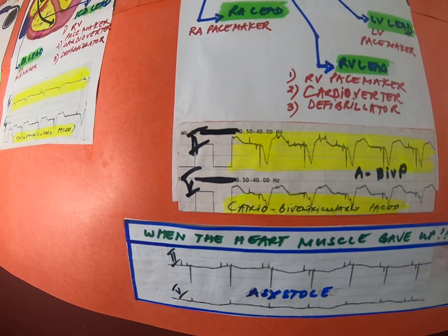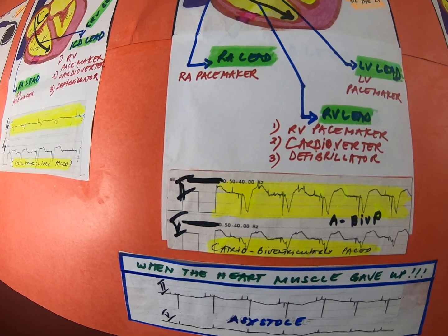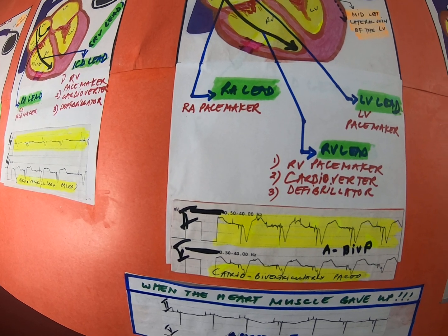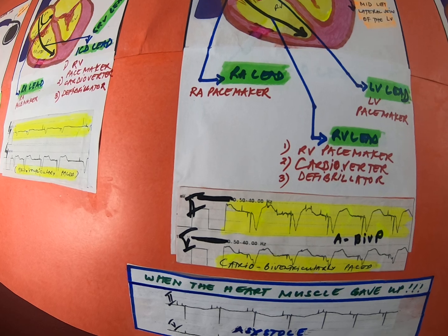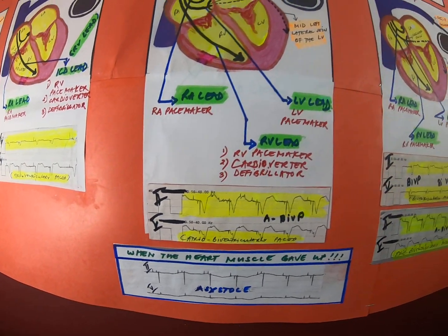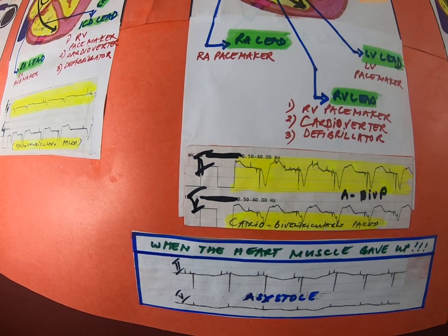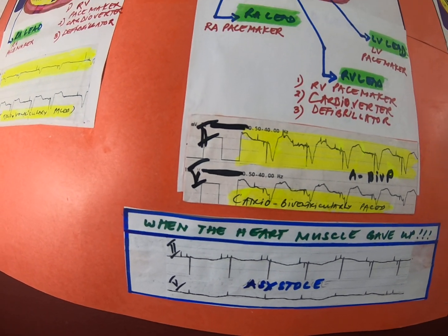So we all know cardiomyopathy patients are getting old. They have more comorbidities, and they are prone to severe infections and more complications. Sometimes in my whole career, I have encountered four or five times of having all devices working, but failed. It's not the device that failed, but the muscle fails. So in here, all the devices are working.